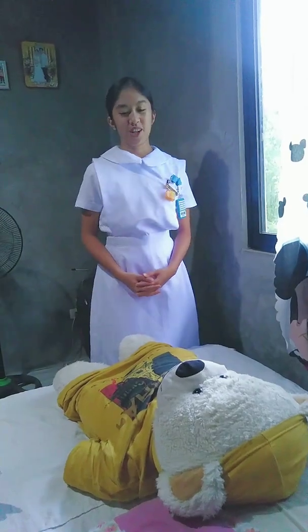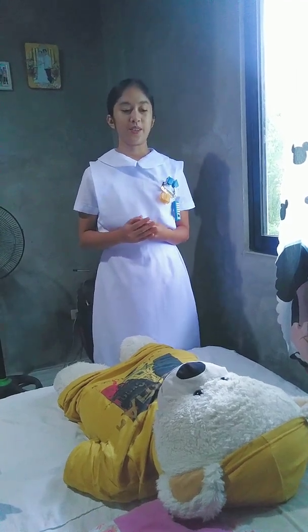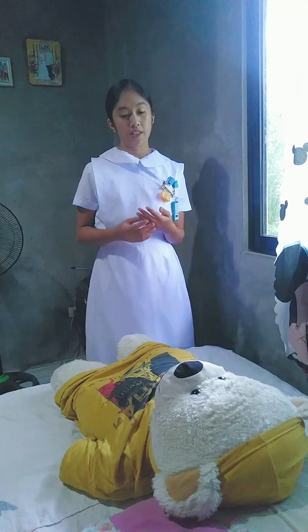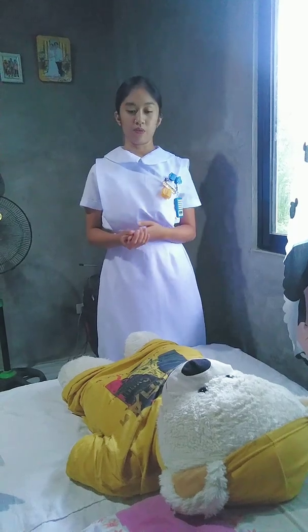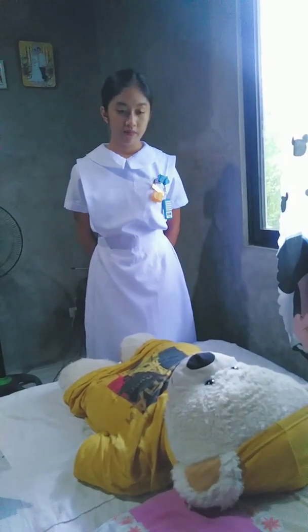Good morning, Mom. I am Jess, your student nurse for today. Are you Miss Park? Okay. So, Mom, for today's intervention, we're going to do the catheter insertion. This procedure, Mom, will be a little bit painful, but it is tolerable. The purpose of this insertion is to relieve the urinary retention, to measure the residual urine, and to allow accurate measurement of the urine output. That's all, Mom, and please be cooperative with me. Can I ask one question, Mom? Do you have an iodine allergy?